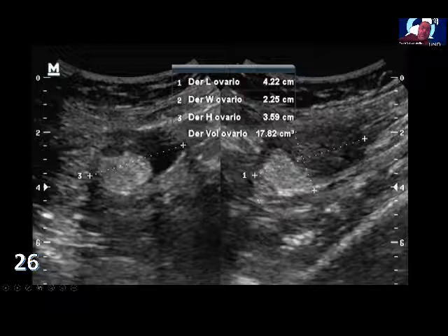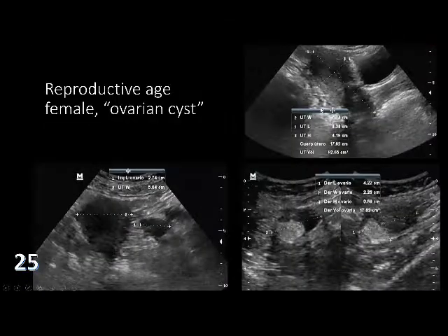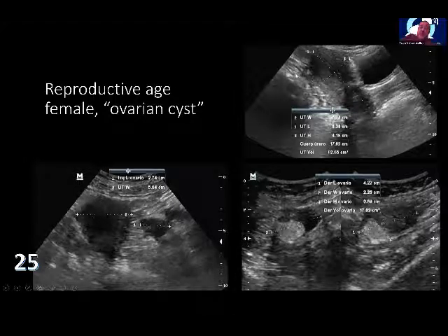A bit of advice: if you use a region of interest like this, you are applying all the resources of the device to the area that you want to see.